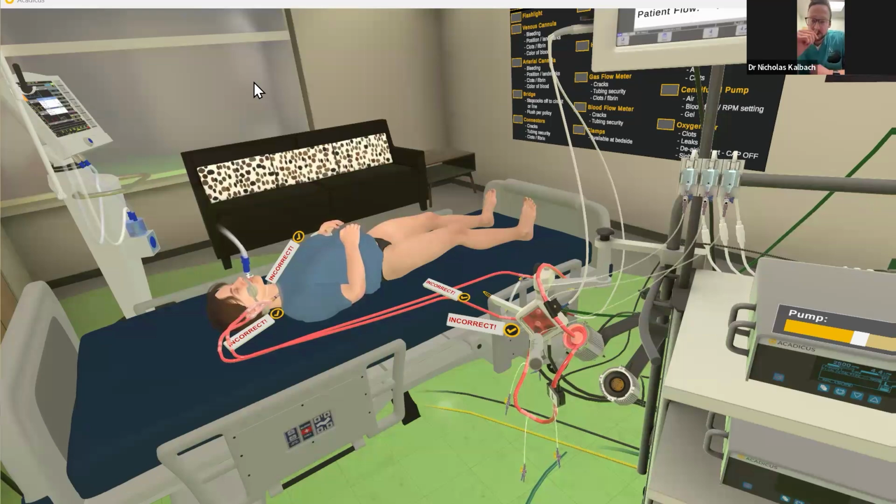It is then, after it goes through this oxygenator and interacts at a microfilament level with the air that's passing through it, it then travels back into the patient up to the site that you see, and it goes back into the return port that I mentioned earlier, goes back to the right side of the heart to be pumped through the rest of the body.